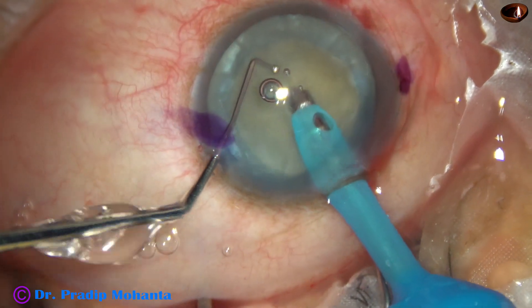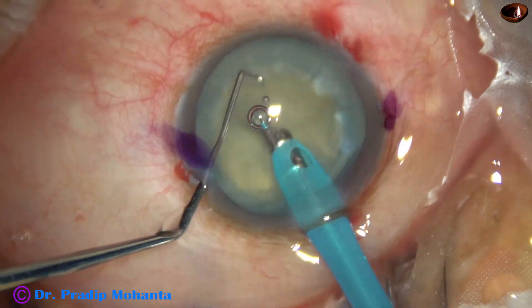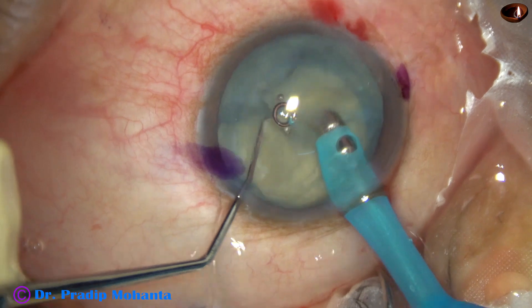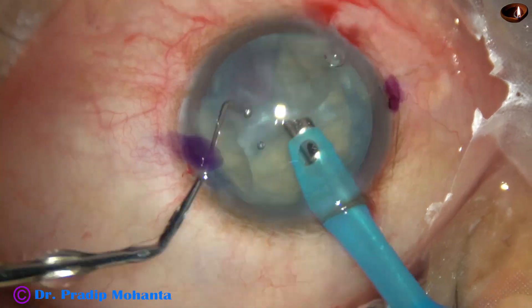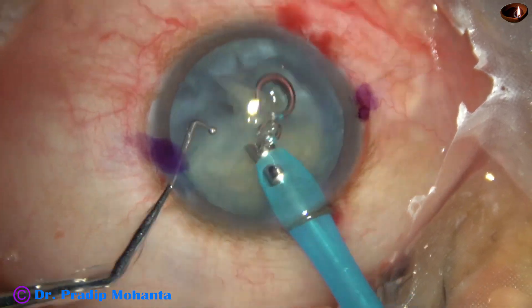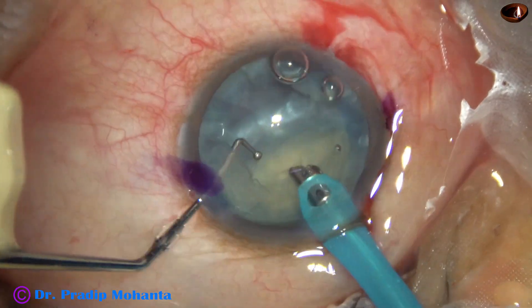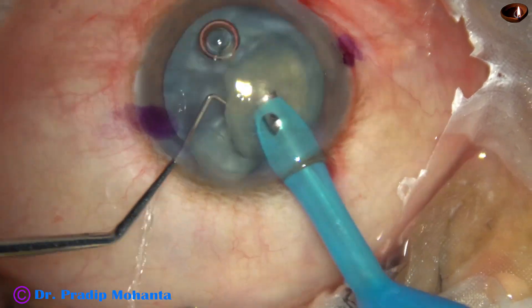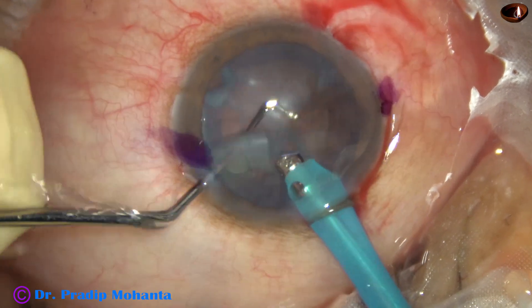I bury the tip into the substance of the nucleus and chop. This is the NATO chopper — a ball-tipped chopper. I call it the NATO chopper because it is the chopper used by him in all cases. He uses a tip length of 2 millimeters or even more — maybe 2.5 or 2.25 millimeters — but this tip length is only 1.5 millimeters.